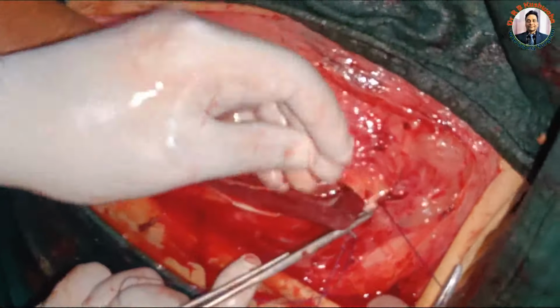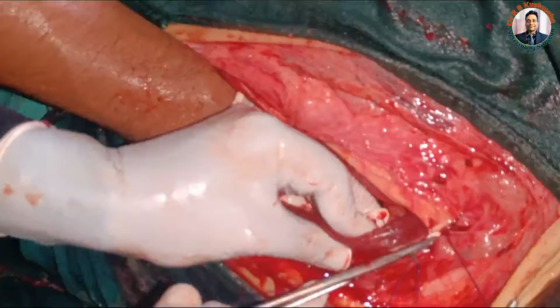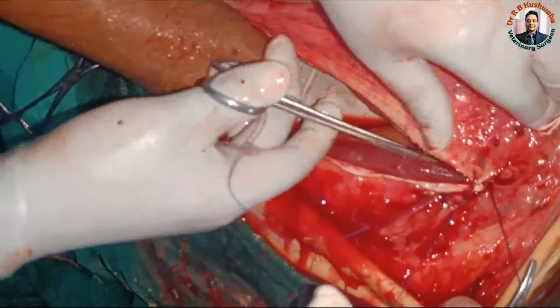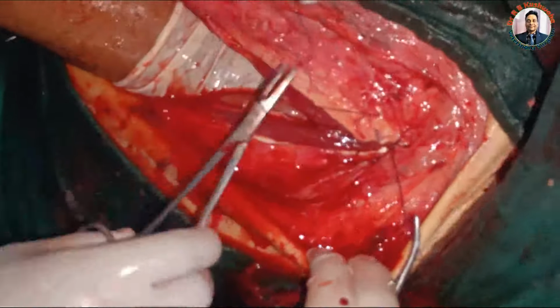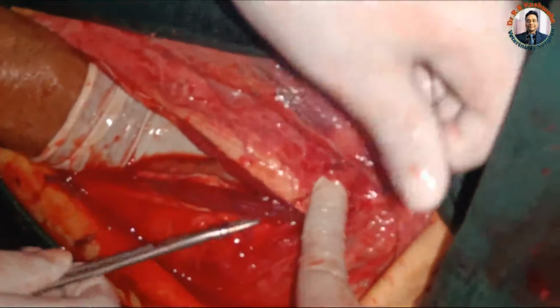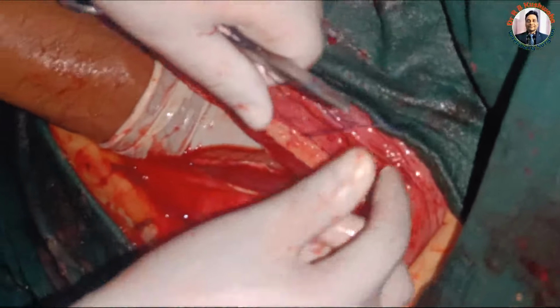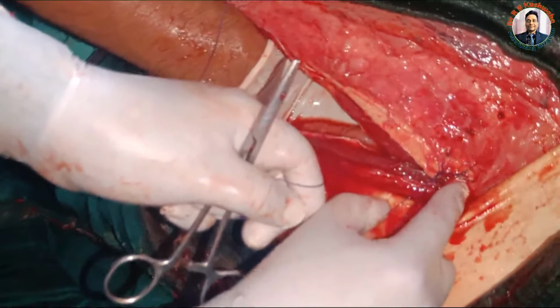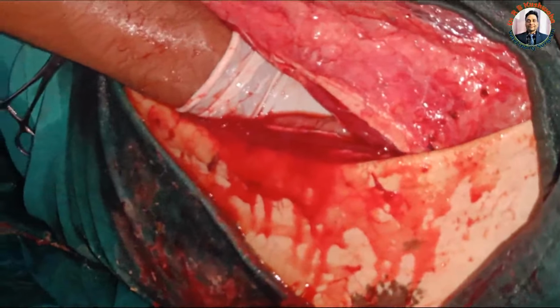So this one is the aponeurotic part. So this one is peritoneum. So here I am going to apply some sort of cross mattress. Cut it. So suturing of the uterus and the closure of the laparotomy incision is very, very important.